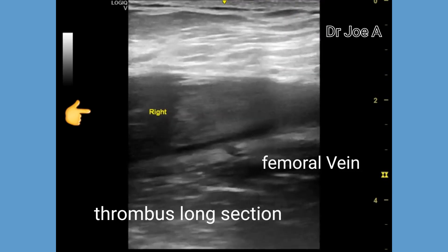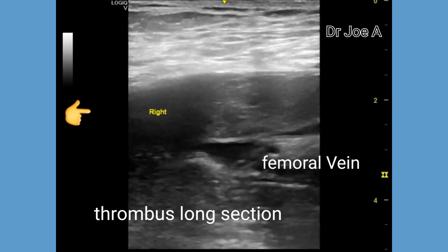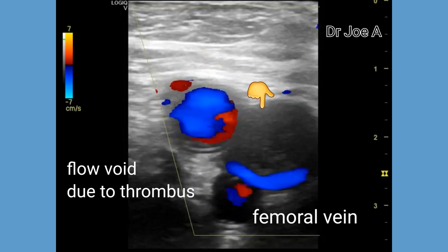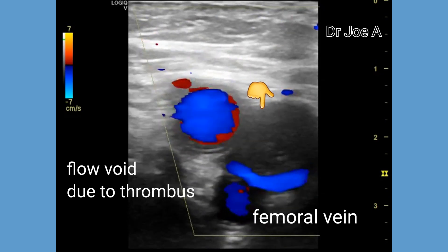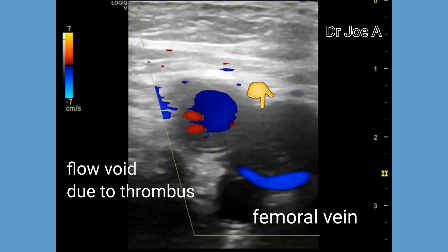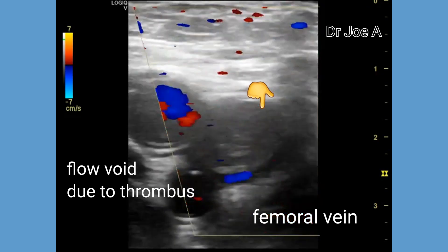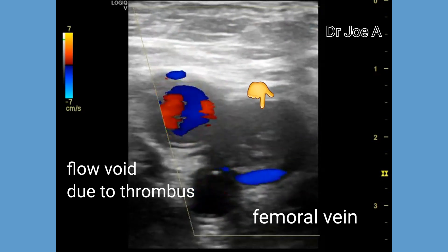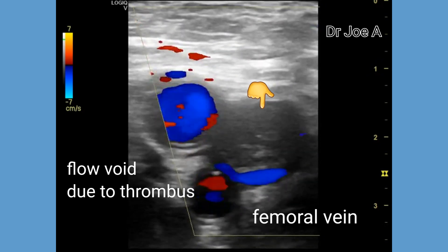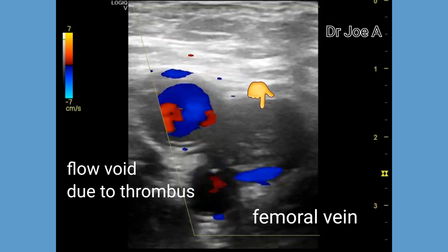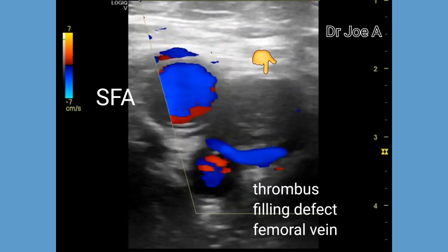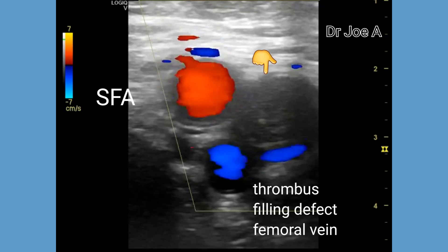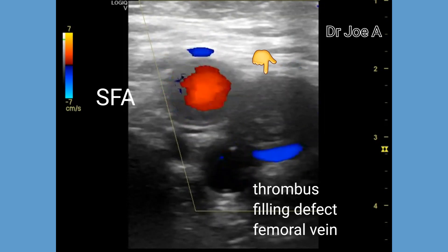If the thrombus proceeds to a chronic post-thrombotic stage, there would be normal or decreased venous diameter. On color Doppler, note the presence of a filling defect or a flow void in the region of the thrombus in the femoral vein. The adjacent right femoral artery shows normal flow, while the right femoral vein shows absence of flow in the region of the thrombus. In cases of chronic thrombosis, one would see rigid intraluminal material, irregular surface of the thrombus, and synechia or adhesions within the thrombus. Fibrotic bands may be present.